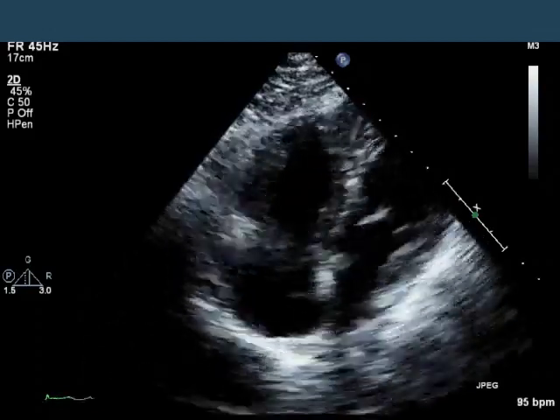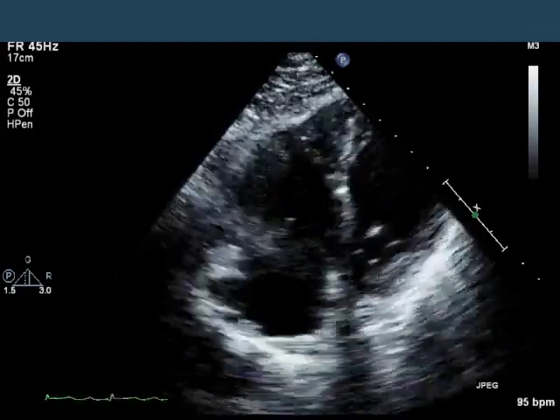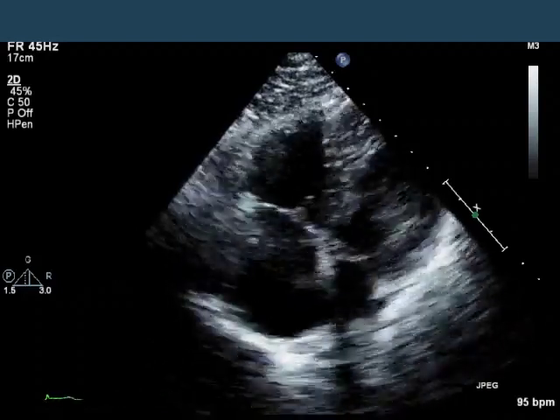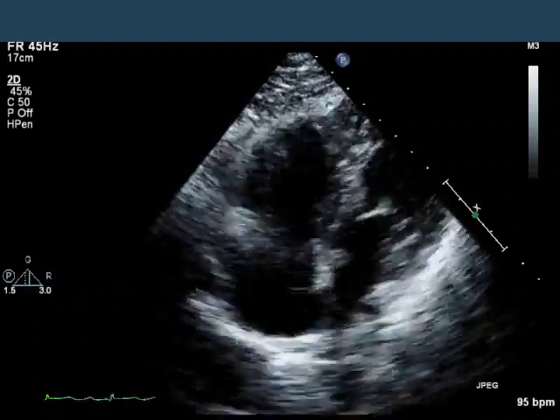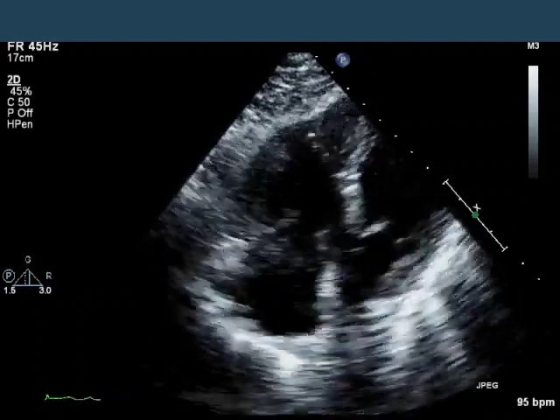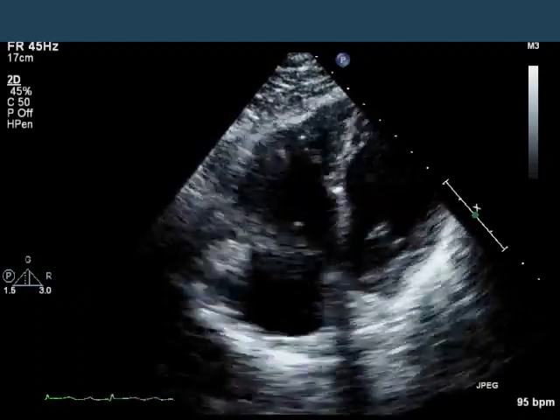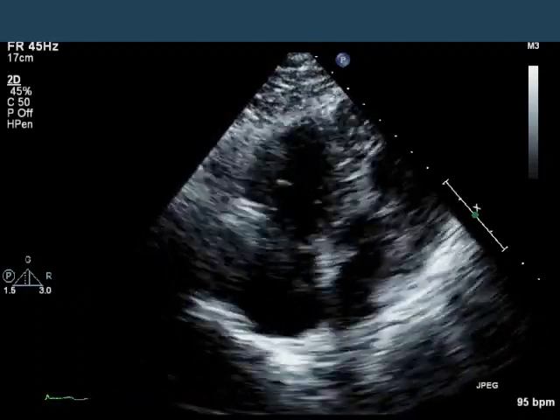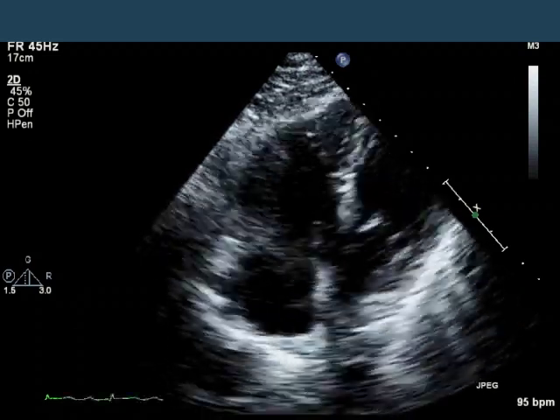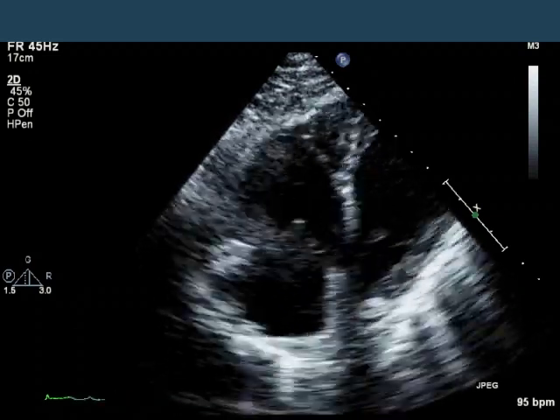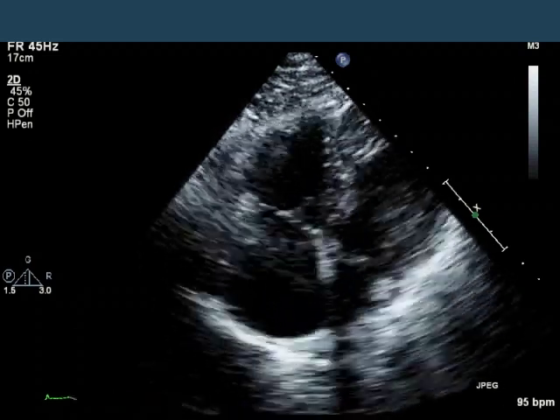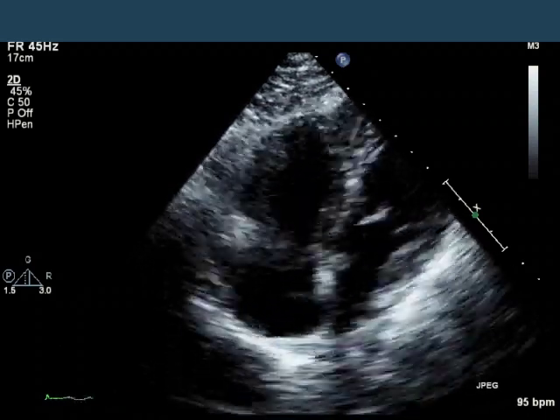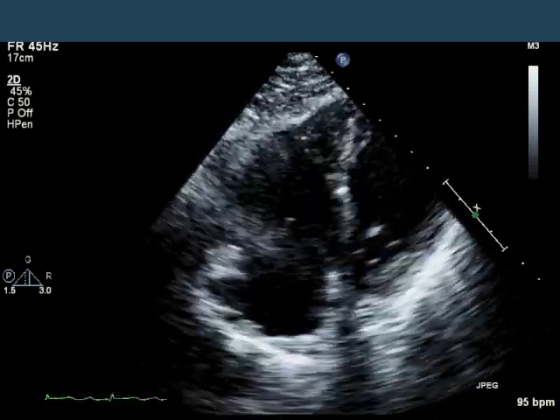Now we have a focused apical view on the right ventricle. You can see here that the base of the RV appears to be akinetic. The RV is dilated, and even though the apex of the RV is coming in nicely, the base and the middle of the RV free wall appear to be akinetic.